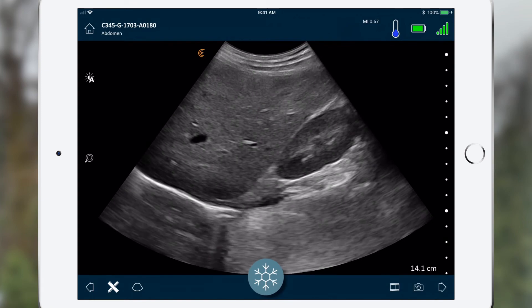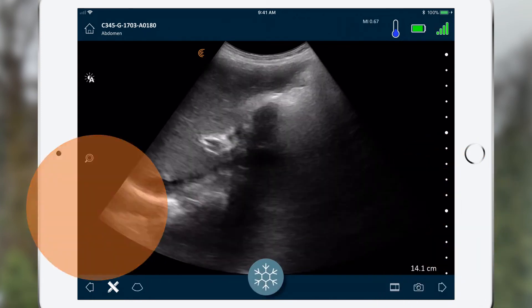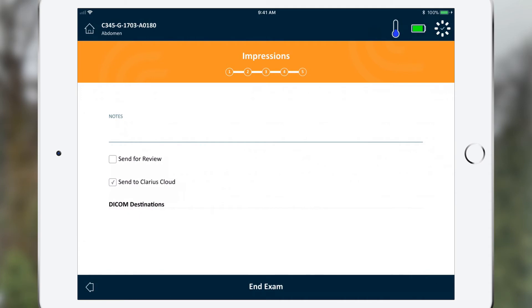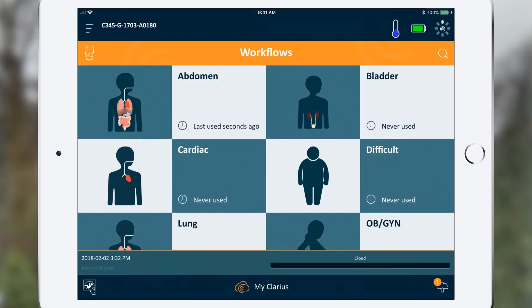Once you have completed your exam, press the arrow button to go to the review page. Here you can review your saved images and video. Press the arrow again when you're done. Select end exam and then submit to complete the exam. Your exam is pending upload to your cloud account and will upload the next time you have internet connectivity.